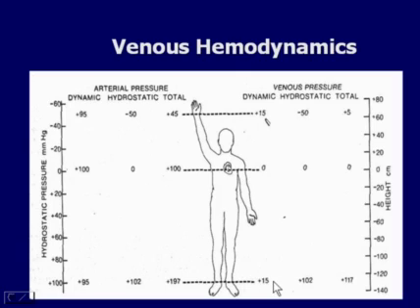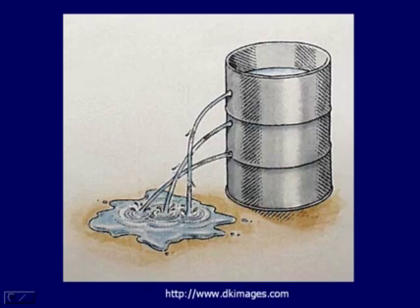The pressure at the ankle is about 15. Obviously, blood flows down a pressure gradient, so it goes from 15 to maybe about 5 or 10 to about 2 or 3, back to 0. But now we've added 100 millimeters of mercury when we've stood that patient up. So we've got about a 7-fold increase in venous pressure, which is great and helps us do our job to push pressure against the valves and see if we can make them not work.